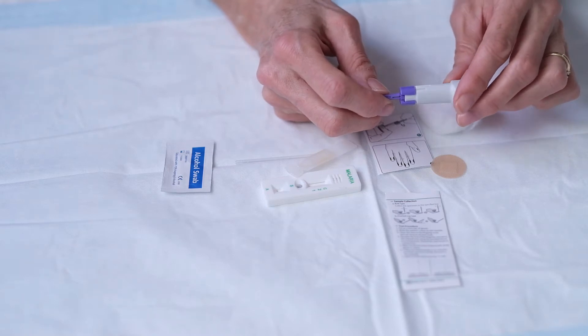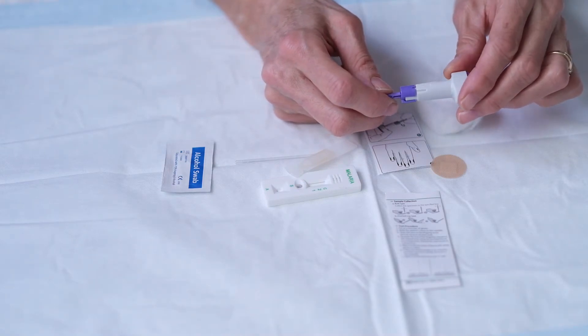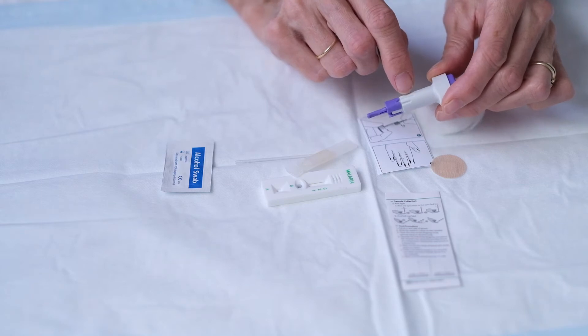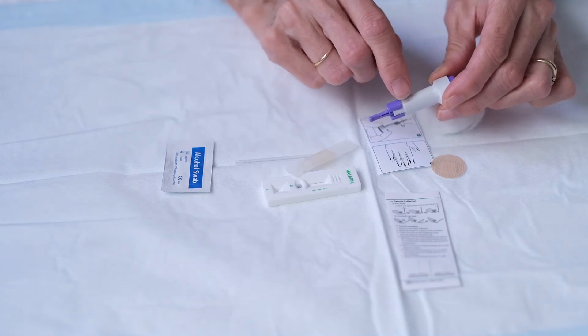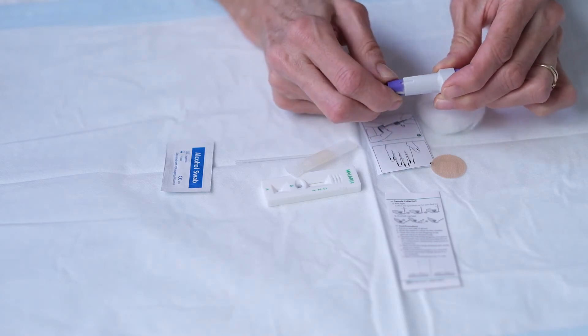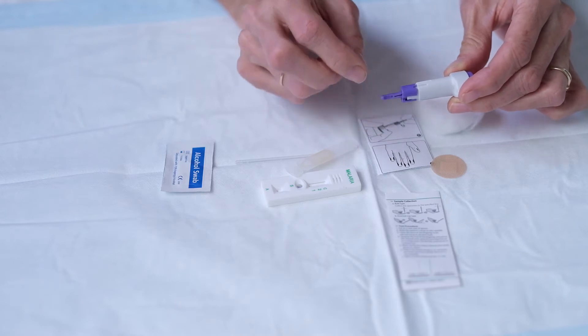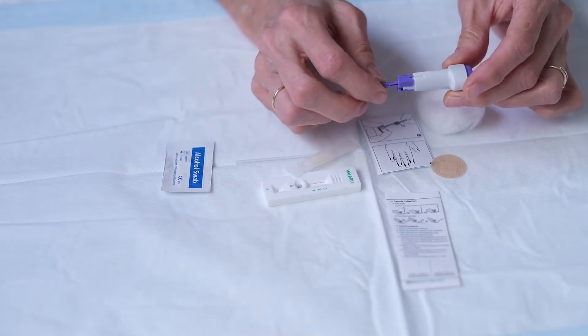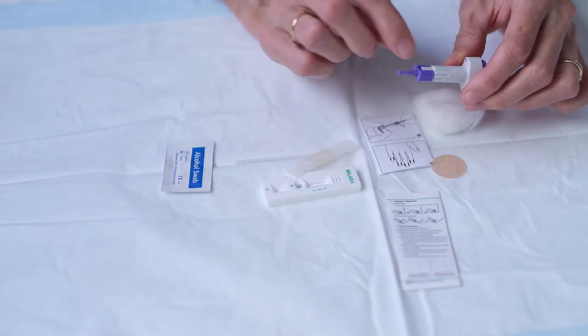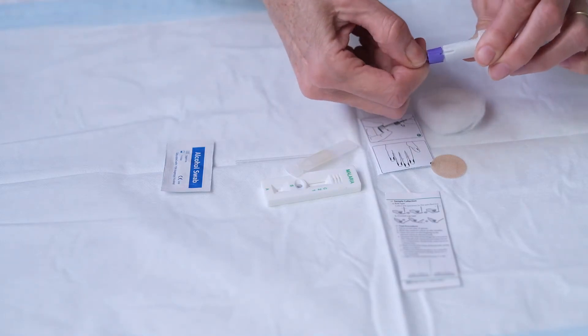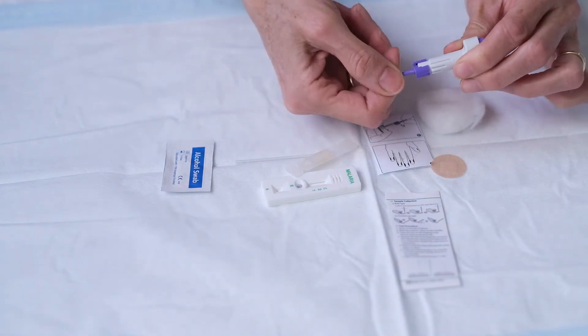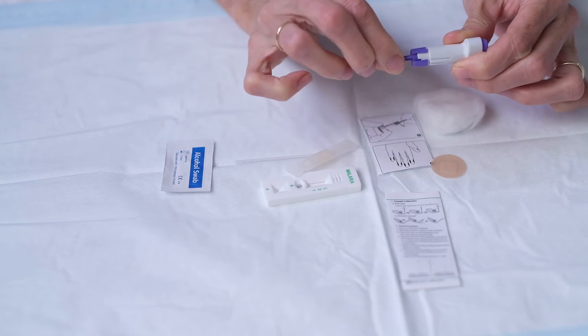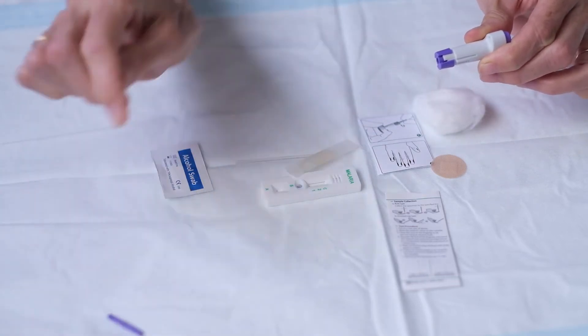Now this lancet has a little dial on it and you can see there's three sort of like a large, medium and small, and you want to turn that to the small because we don't need it to be very deep. The lancet inside is actually protected by this little cap so we're going to take the little purple device off and throw that away.